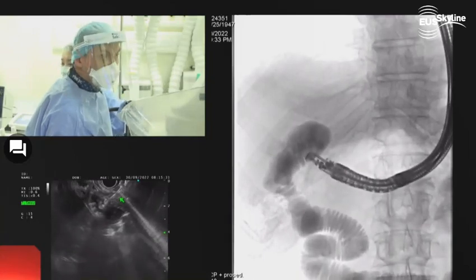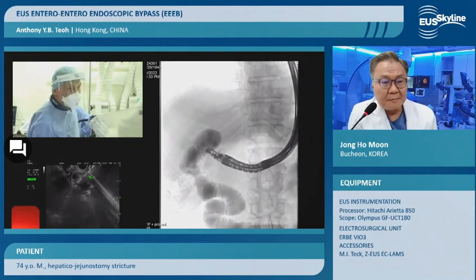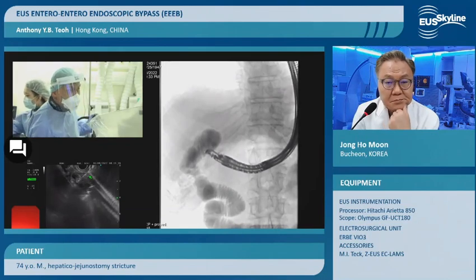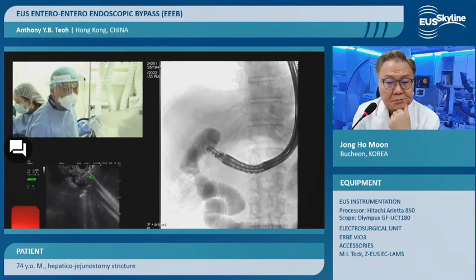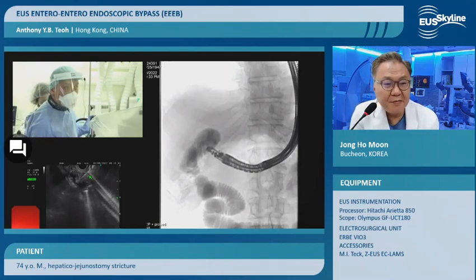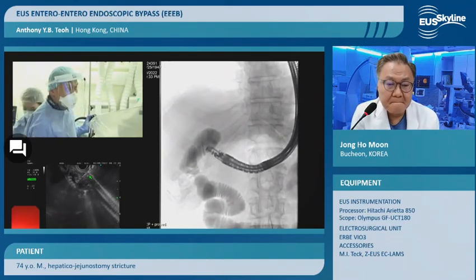So you will do direct penetration without guide wire? Oh, for this case, maybe dangerous. So I will use a guide wire to guide the insertion for this one. You can use it because it's fixed after anastomosis. Yeah, but the duodenum is not very distended.